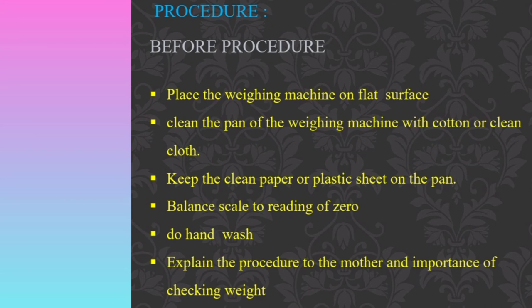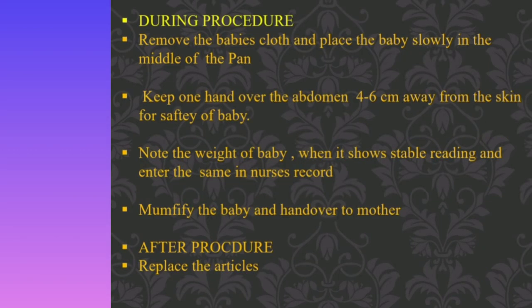During the procedure, remove the baby's clothes gently and place the baby slowly in the middle of the pan. Keep one hand over the abdomen, 4 to 6 cm away from the skin, for the safety of the baby. Note the weight of the baby when the scale shows a stable reading, and enter the same in the nurse's record.